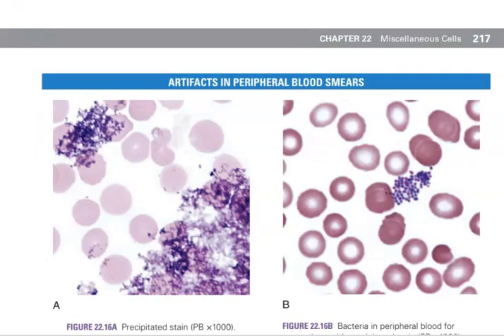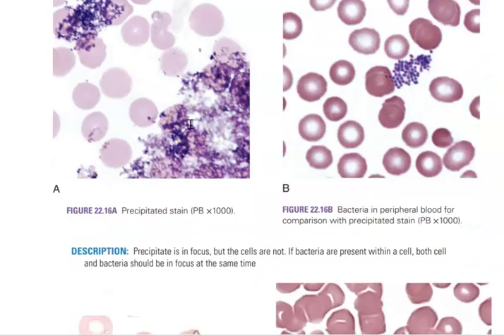Now, if you will, flip over to page 217 in your atlas. We're going to talk about some different artifacts that you can possibly see on the blood smear slides that you make to observe under the microscope. So let's look at figure A first. Figure A is looking at precipitant from your stain.